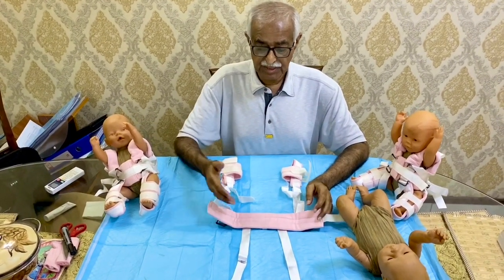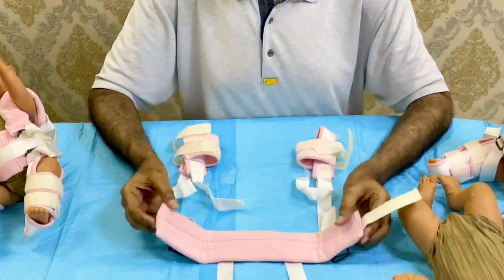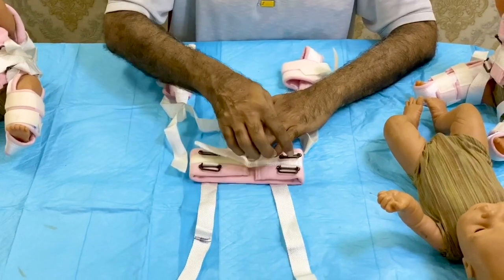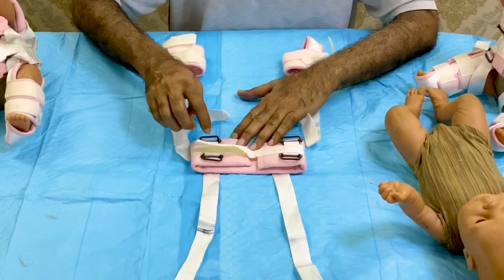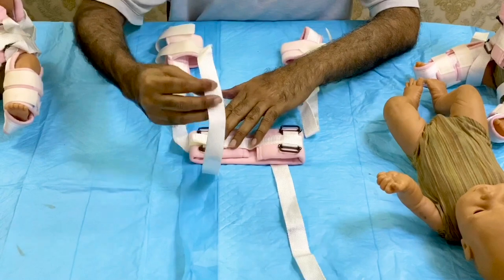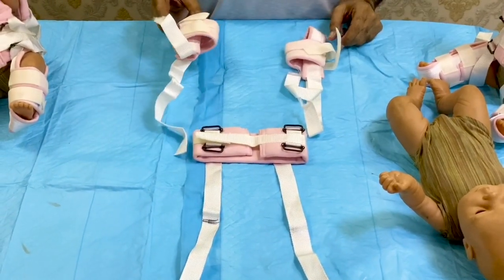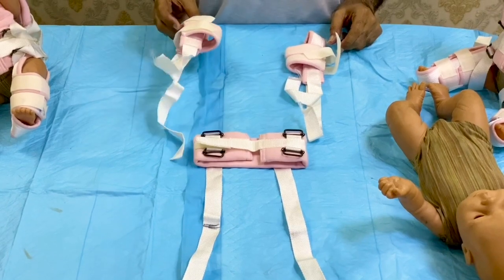These are the components of the Pavlik harness. This is called the chest halter with chest belt and shoulder buckles, and the anterior strap buckles. These are the shoulder straps and this is the foot strap, for stabilization and maintaining the position.